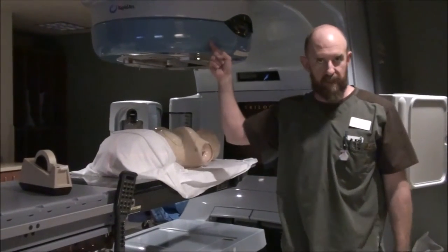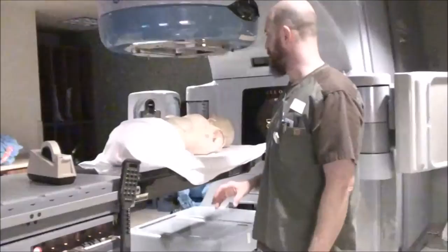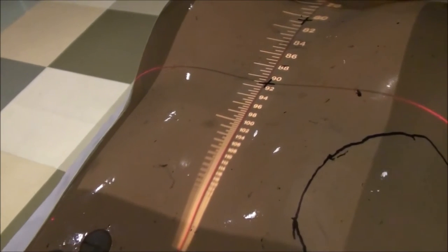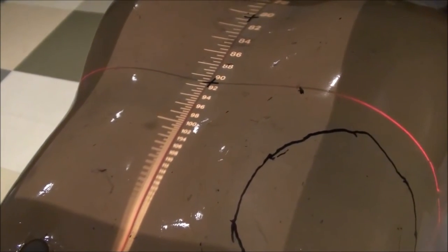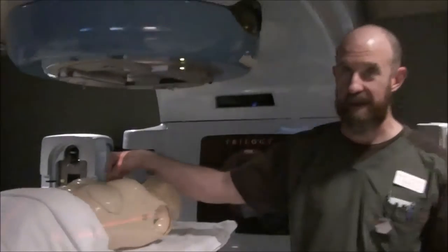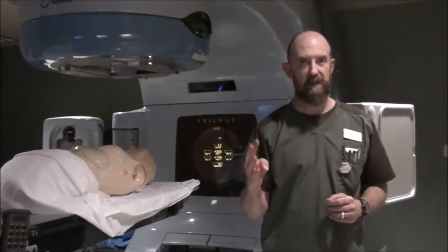Once you have those done, rotate back up. The next thing you're going to do is physically unlock your table and move the CR to each dose point. At that dose point, notate the SSD — in this case, it's 91. Move your table to the next dose point: 93.2. Move to the next dose point: about 96.5. Now you've got all four dose points because you noted your SSD for your CR. So you've got four SSDs, and now we need a separation at all four of these points.